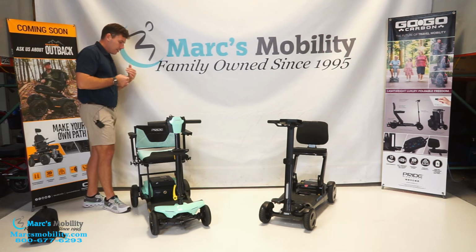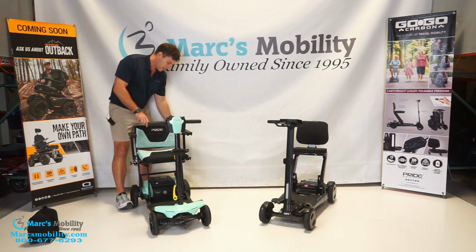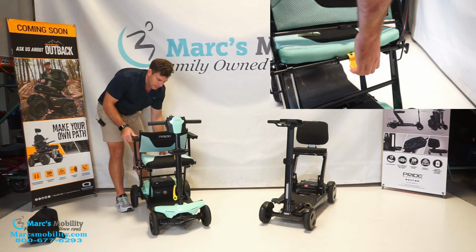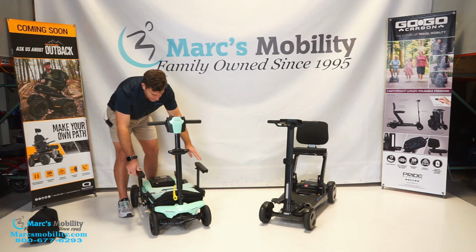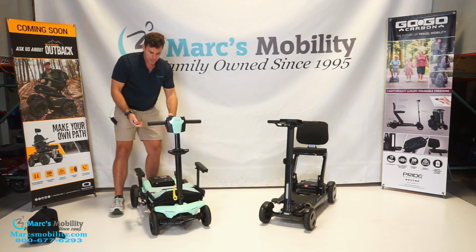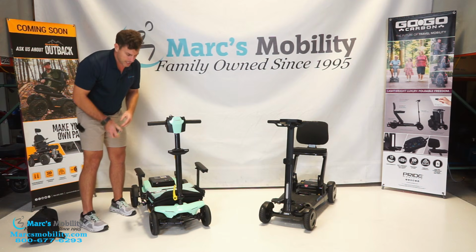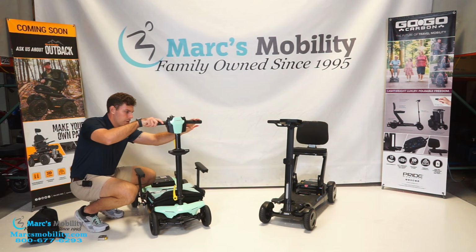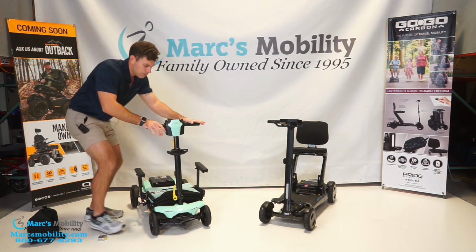And then from here, you are going to have a yellow lever in the back of the seat. You're going to lift up on that lever and then let the scooter begin to fold down. And that's going to be down in the folded position. And then from here, once again, you can take your tiller and lower this down as well so that you get to the lowest height.